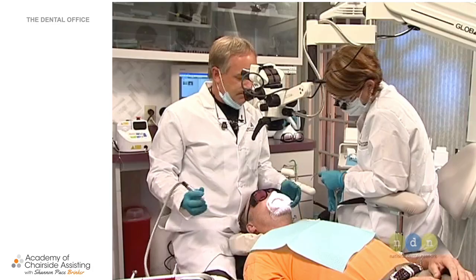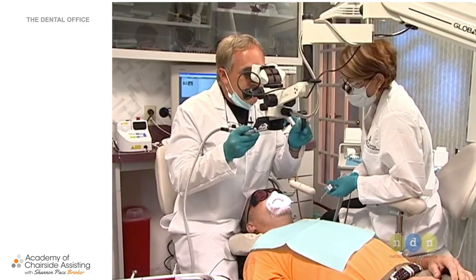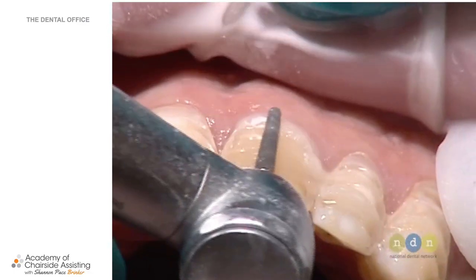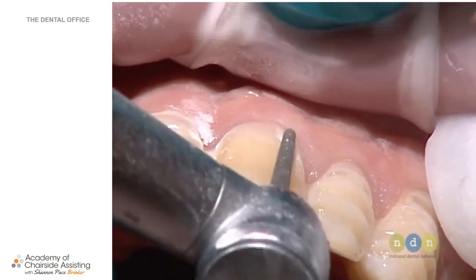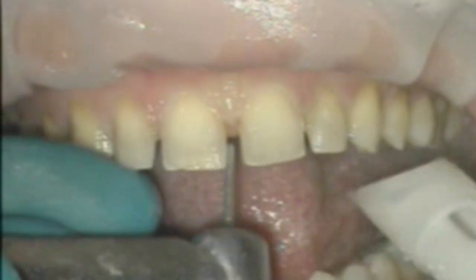Now, let's look at some video here. So you'll notice here what I'm doing. Okay, so let's go ahead and do our... And I'm just going to turn his voice down so I can talk over it. But here, let's familiarize ourselves with exactly what the doctor is doing. So he's preparing the teeth, and you see where my suction is. I'm utilizing a high volume suction, and really, again, looking at where you are and just sucking that water that's coming out. Let's look at another video here, how close we are.